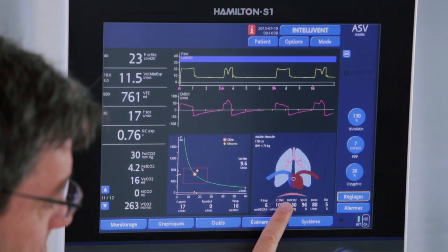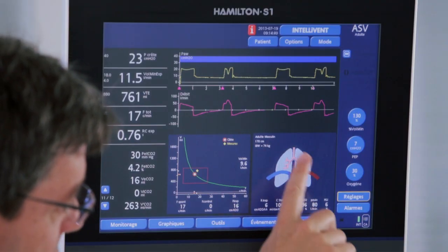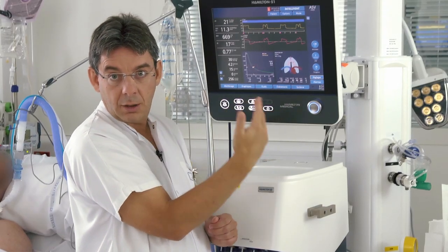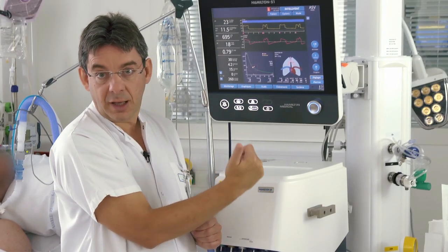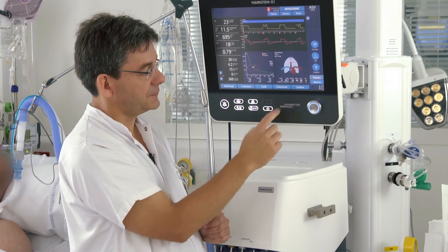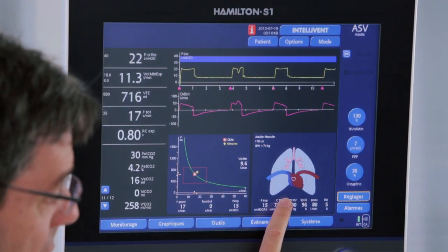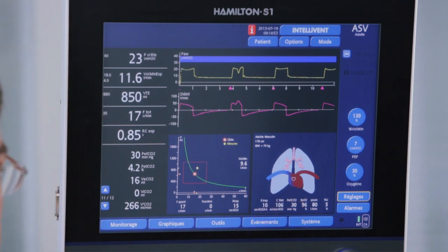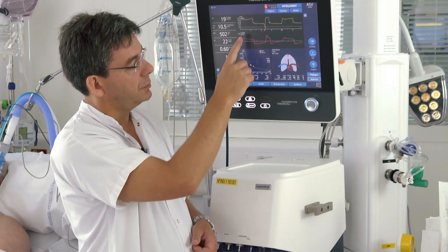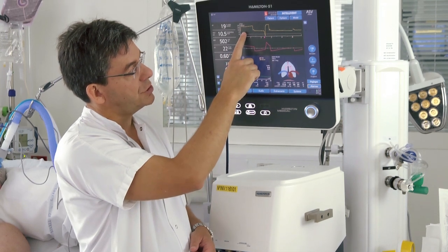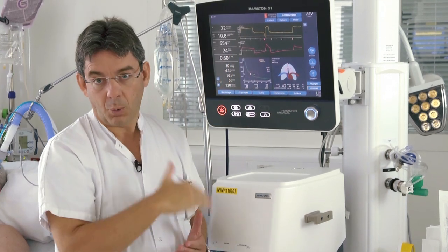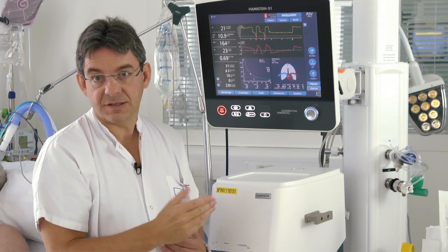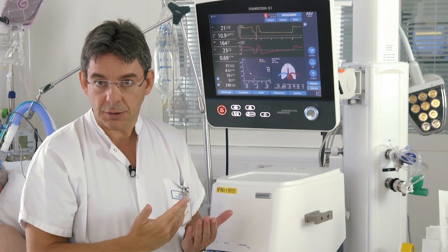On this panel we can assess the respiratory mechanics with pictures showing the static compliance and the inspiratory resistances. We see the diaphragm indicator showing that the patient is actually active. At the top of the screen we see the pressure and flow waveforms, which are also very useful to assess patient-ventilator synchrony.